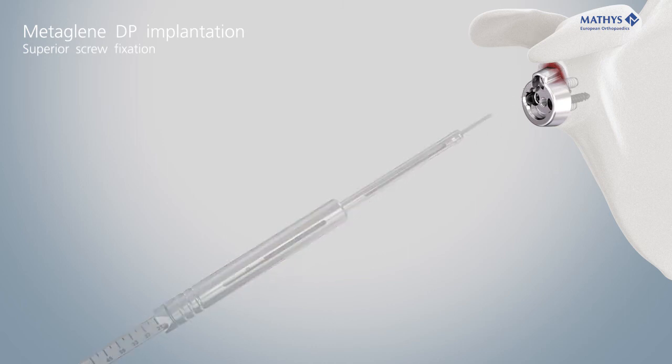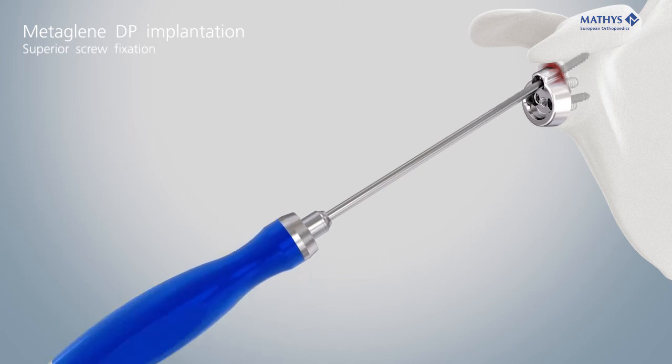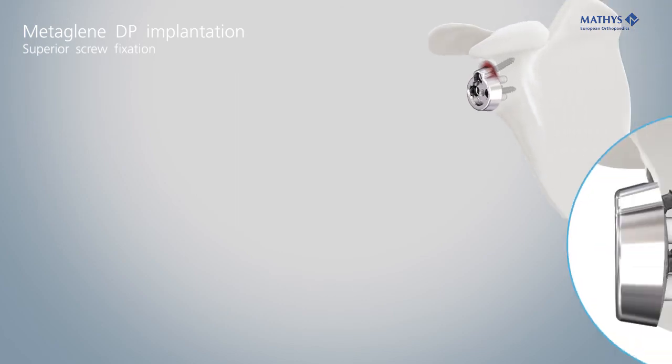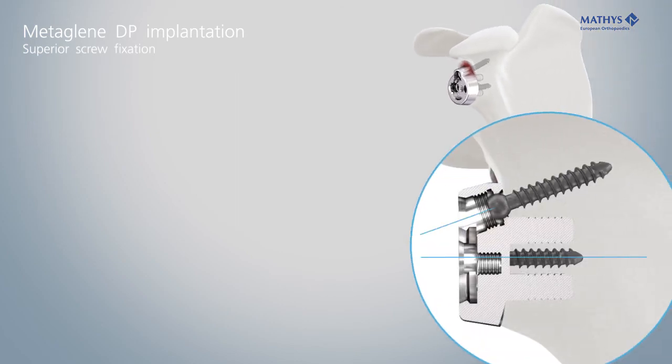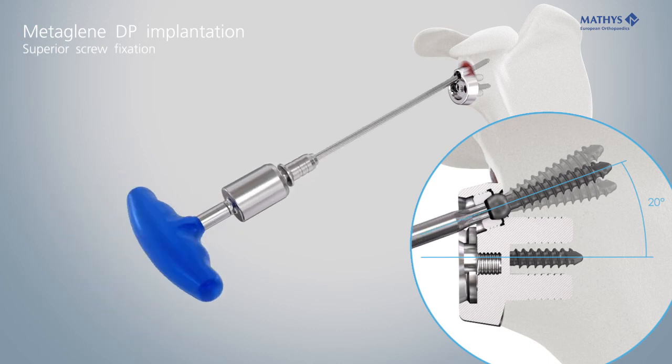The superior screw must be locked with the cap in order to lock the desired screw angle. Align the locking cap with the neutral screw orientation of 20 degrees and the concave side facing the screw. Tighten the cap with the torque wrench until it clicks.